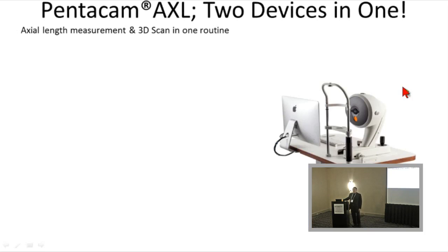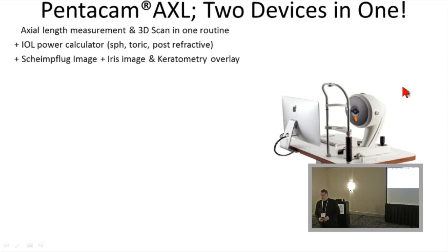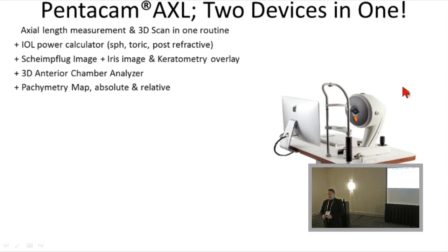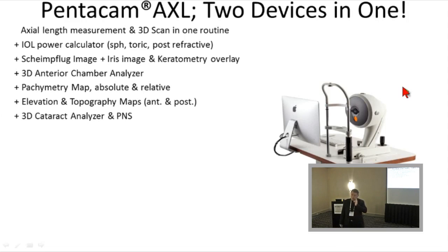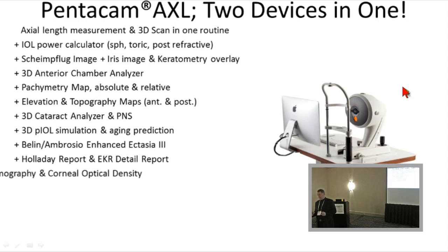Oh, I do want to mention one more thing. The Pentacam AXL. First of all, they're going to put the Holladay 1 formula. It's already done. It's just a matter of being at this show on the Pentacam. So you'll be able to do your IOL calculations actually on the Pentacam using their IOL module.